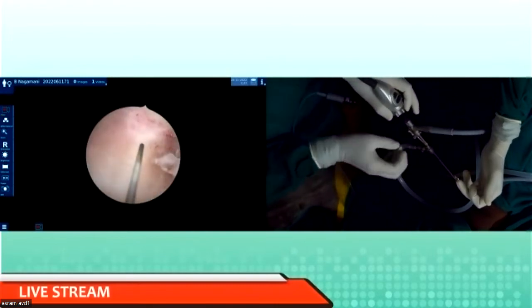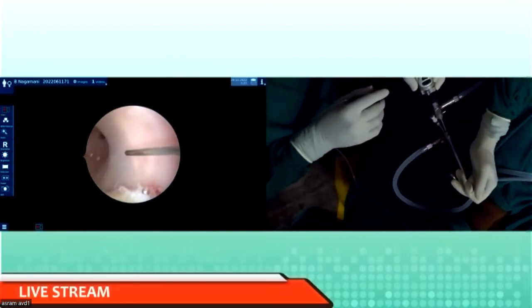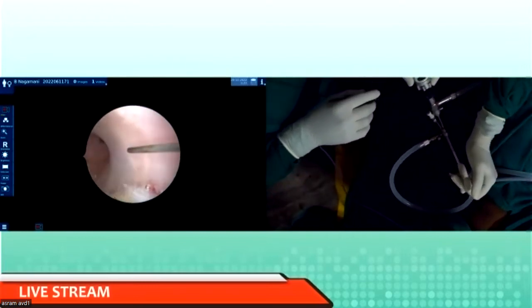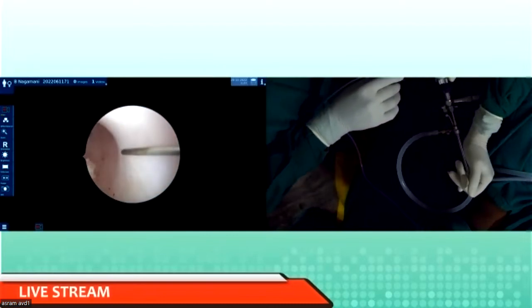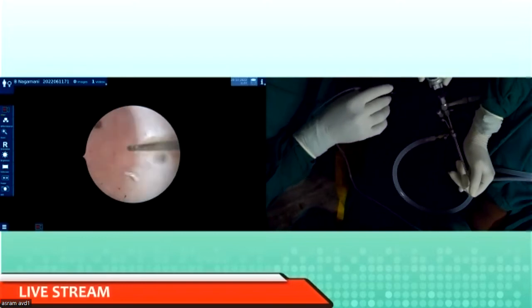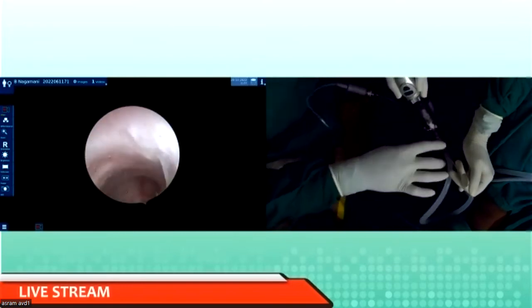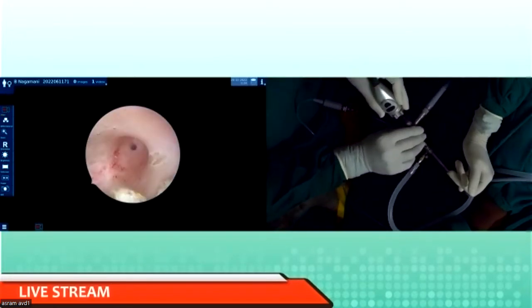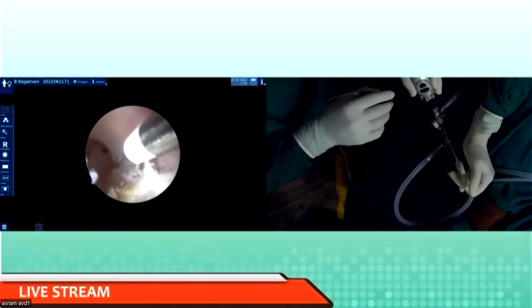And I'll also show you what is called a lateral metroplasty. When you want to do lateral metroplasty, you just, look at that. Now that ostium is not seen. You just do a few cuts like this. This is lateral metroplasty. So when you do that lateral metroplasty, you should be able to see the ostium, and this lateral wall and that ostium should be in alignment. Okay, sir, this is lateral metroplasty.